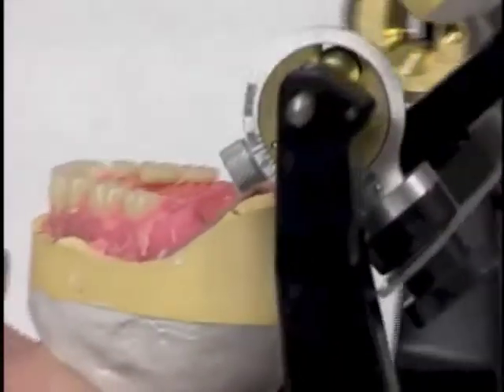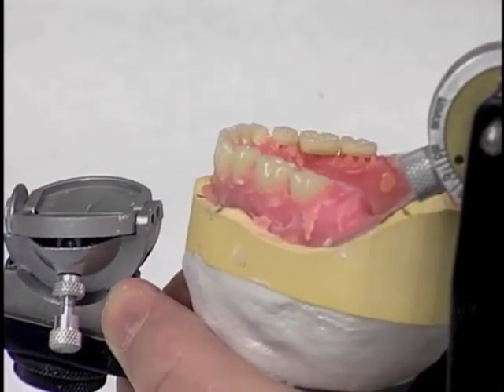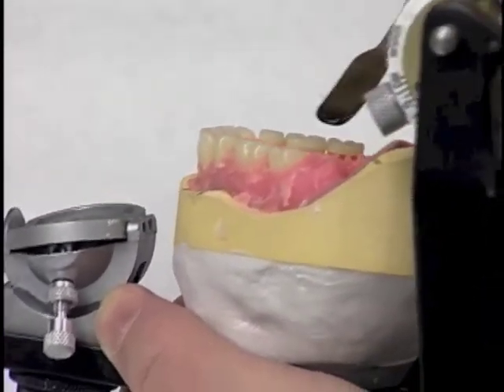Particularly on the linguals of these teeth, we will notice that there are some spaces there, so we need to flow some wax into that.